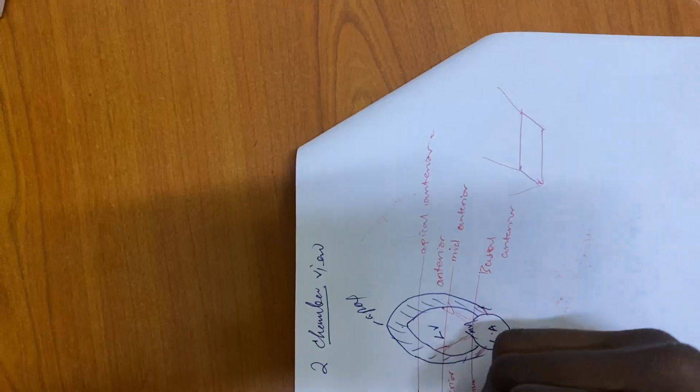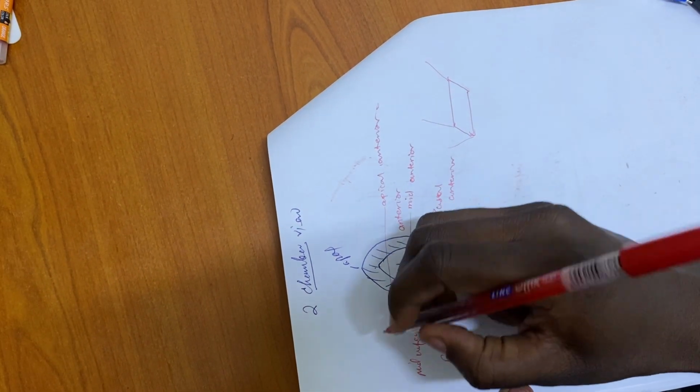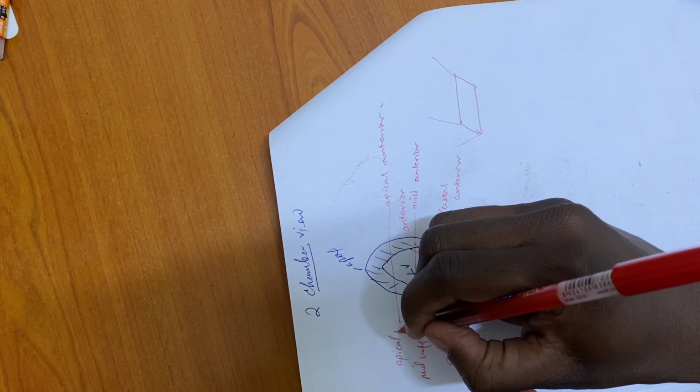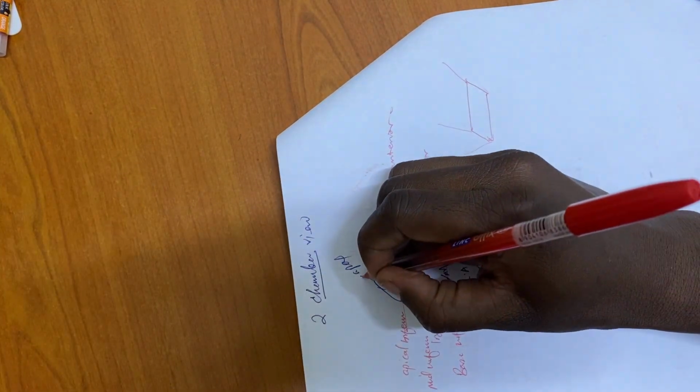This is basal inferior, mid inferior, then apical inferior, and then the apex.